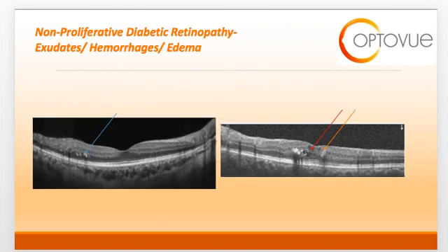Another common finding in non-proliferative diabetic retinopathy is the formation of hard exudates. A retinal exudate is really a composition of lipid material that has leaked from damaged capillaries. Hard exudates appear as hyperreflective clusters in the retina, specifically at the outer plexiform layer.